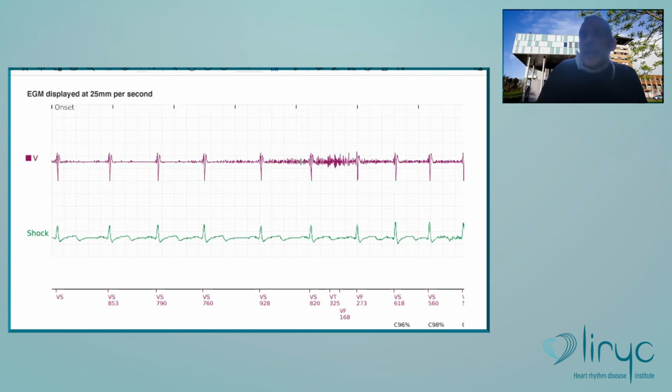So I don't think so. If you can replicate pectoral myopotential, there is a lead dysfunction, and then you need to change the lead. Of course, you need to consider the patient and see if he's very old or something like that, but you need to do something to avoid the shocks. And the solution is clearly not to modify the sensitivity.